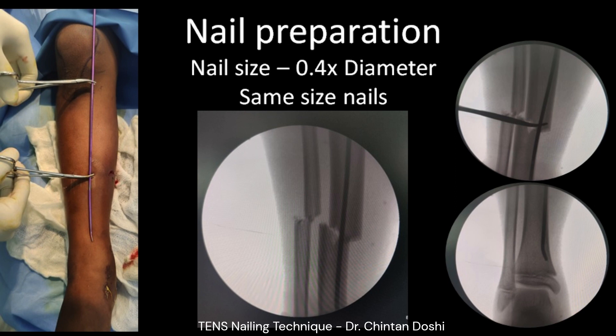Nail length is marked by keeping it over the limb. The required length from the entry point to the distal metaphysis is identified, and the level of the fracture site is marked on the nail as shown, to plan the maximum bending area.